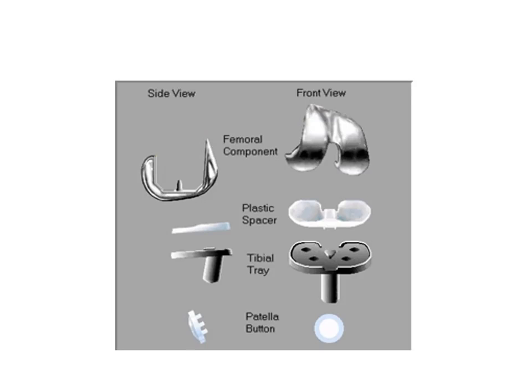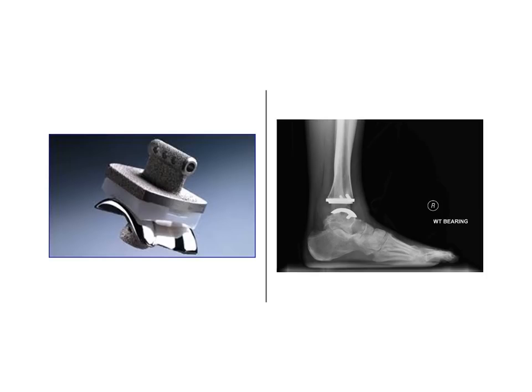This is total knee replacement. In total knee replacement, we have a femoral component, we have a tibial component, we have the intervening plastic spacer which substitutes for the meniscal layer in between, and then we have the patella which is replacing the patella for the patellofemoral articulation. This is total knee replacement. I believe they can ask you any component out of it. I am telling you two more varieties of replacement, although rarely done, but you must know the implants.